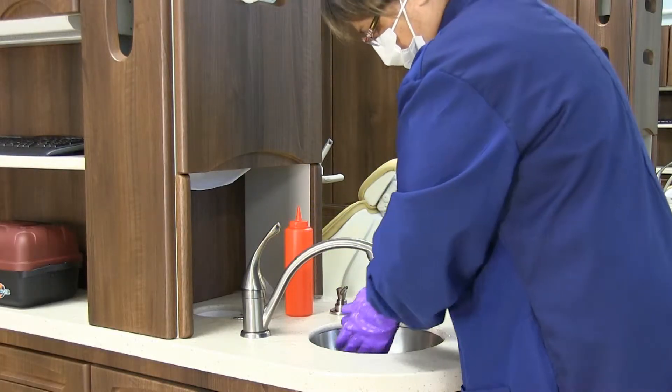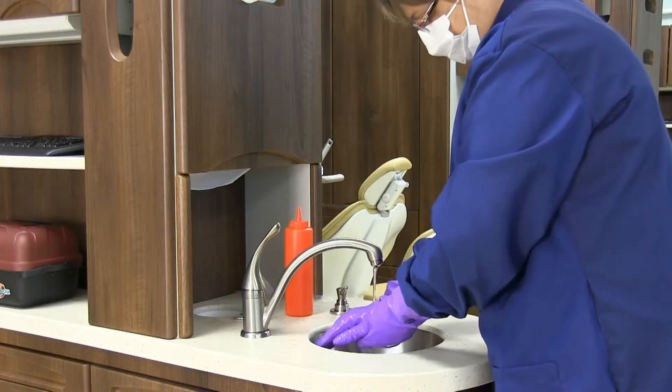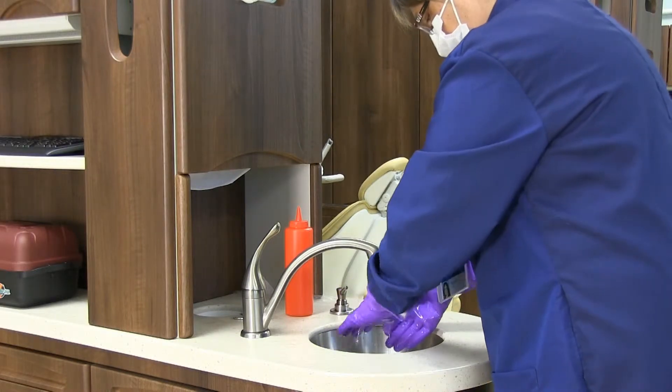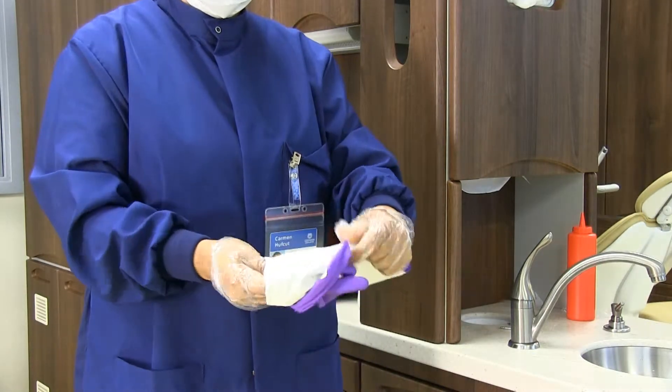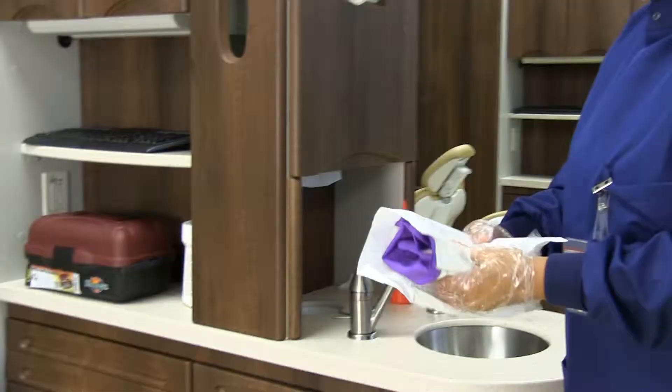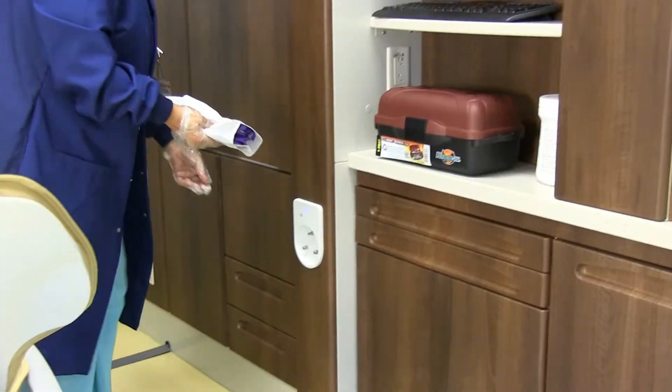Then wash utility gloves, followed by wiping them each thoroughly with a disinfectant wipe. Turn them inside out, wrap in paper towels, and place them in the bottom drawer of the cabinet.